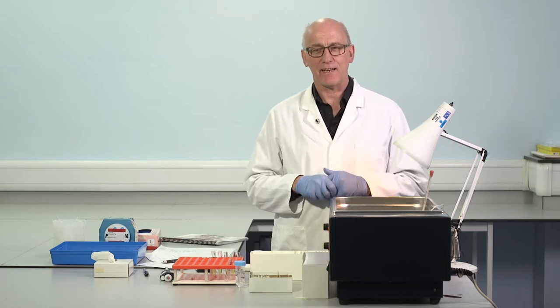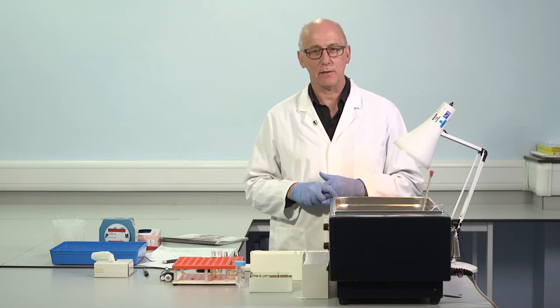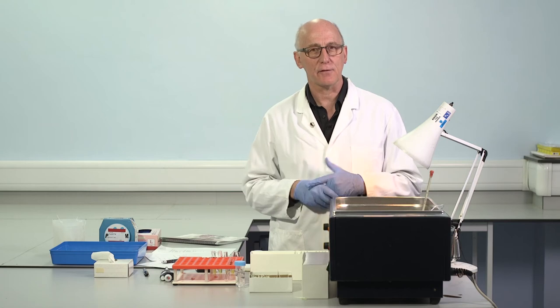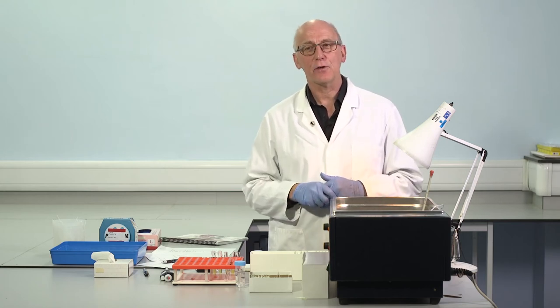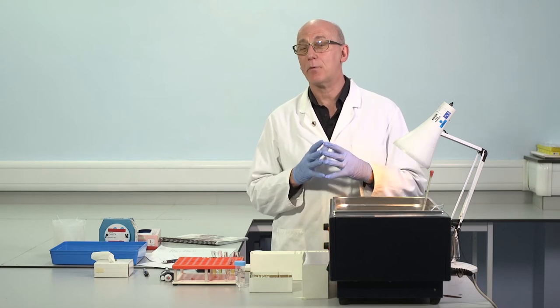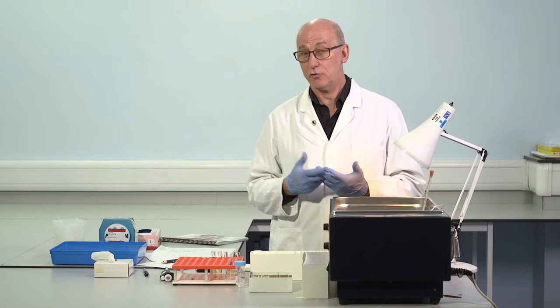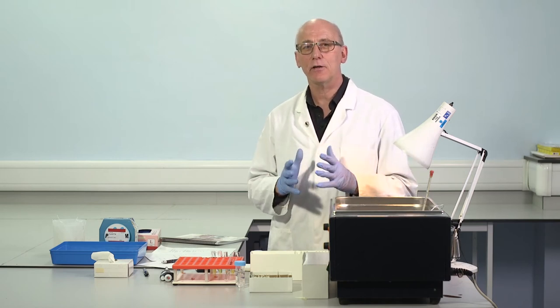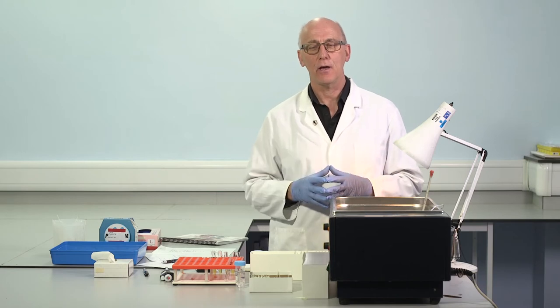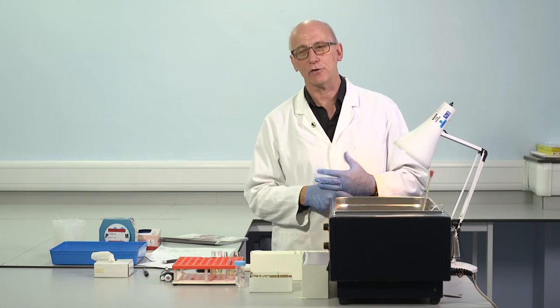So where do we access those? Well, what happens in my centre is that we use volunteers from hospital staff. And if we do that, laboratory staff usually, then we need to have an ethics process in place to deal with it. Those normal subjects should give written informed consent to give a blood sample in the knowledge, with an explanation, that this will be used to perform tests of hemostasis in order to construct reference ranges.